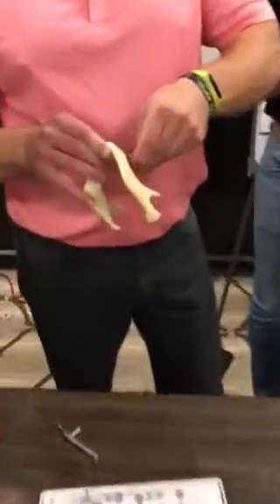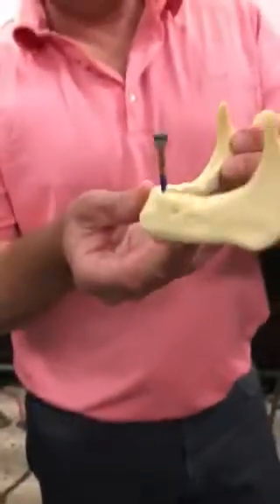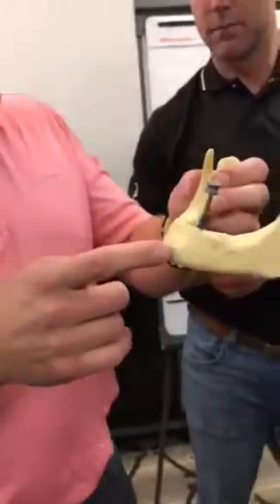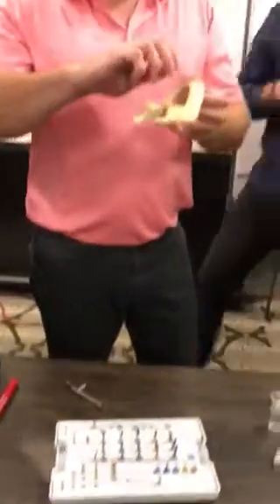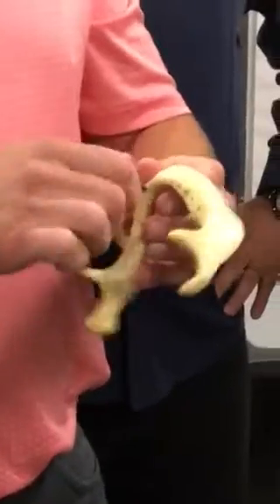I wish I had a long handle to get it started. Okay, see this? So this is a 4-3 by 11 and a half, right? It's already biting into — it's grabbing this helix implant to take it down. That's huge.